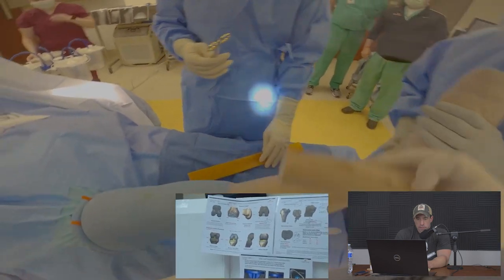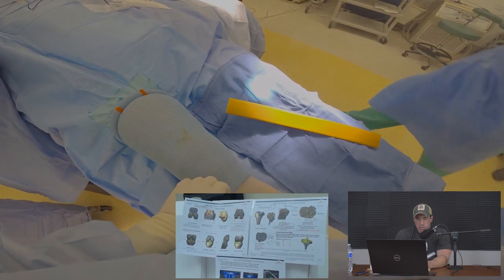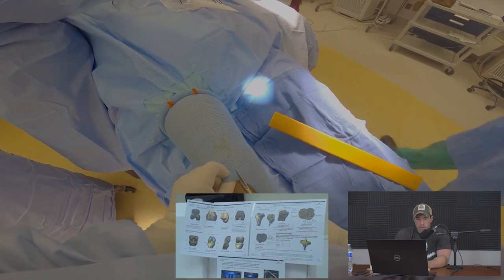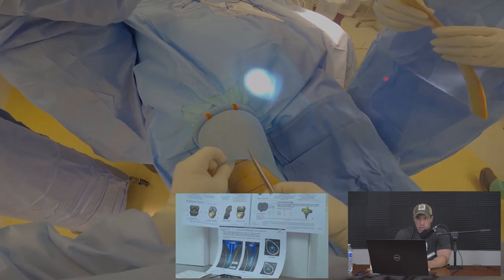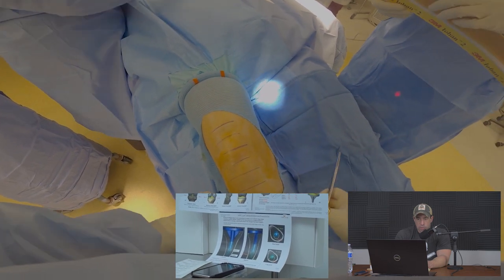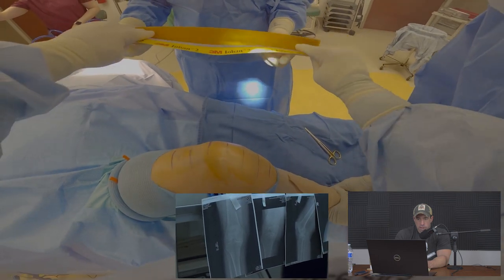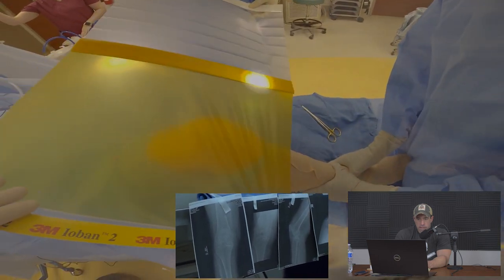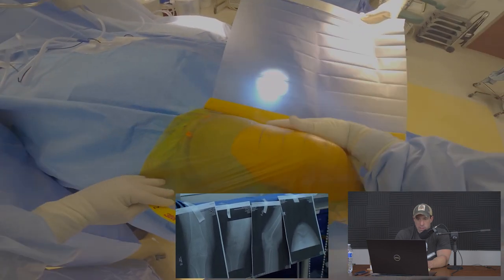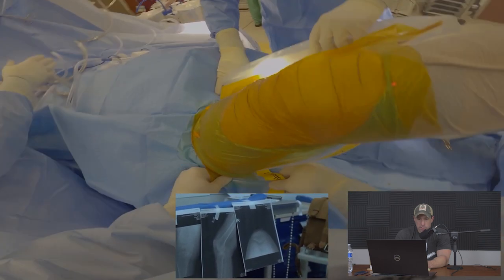In the background you can see the patient-specific plan for this case, showing where the implants will fit and what the resection levels are. We're making a perforation in the wrap associated with the tourniquet, then applying an adhesive drape impregnated with betadine to ensure sterility and prevent bacteria on the skin from surfacing during the procedure.